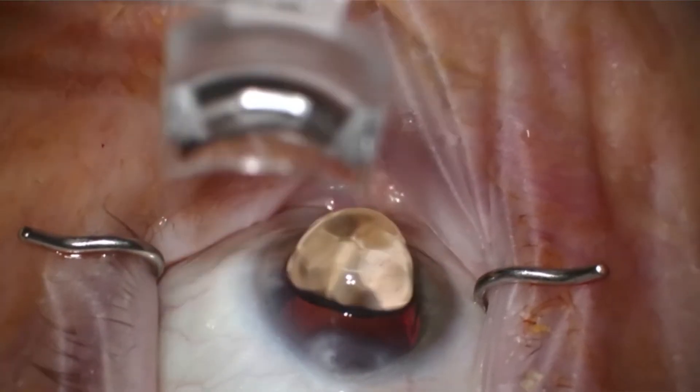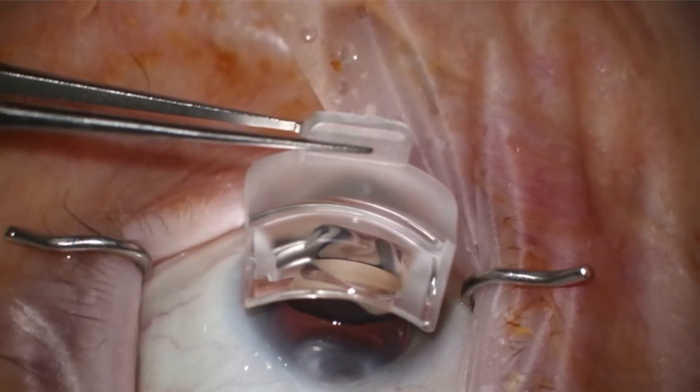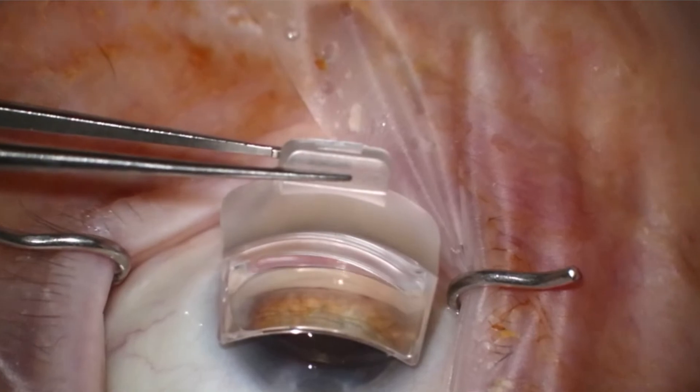When initially placing the lens on the surface, a quick way to orient which direction the hands-free gonioprism should be placed on the eye to gain the proper view is to assess where the majority of the lens is facing at the level of the tip. Where there's more bulk of the prism facing you the surgeon — you can say 'more towards me' — and quickly orient the prism in the proper direction.